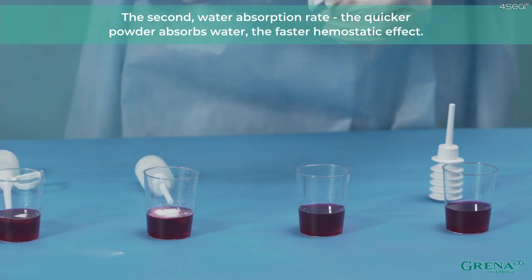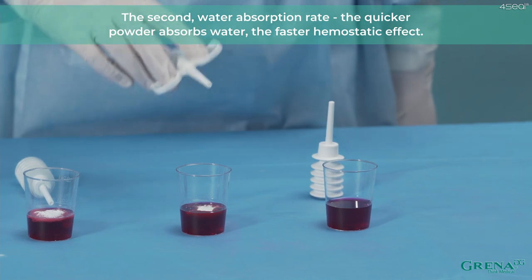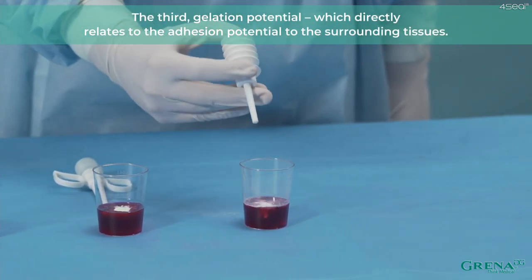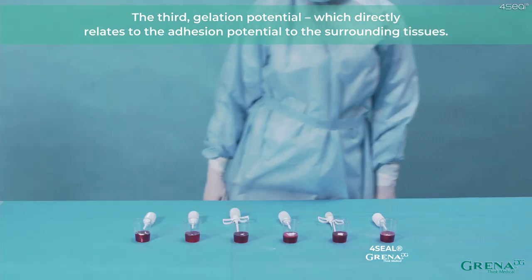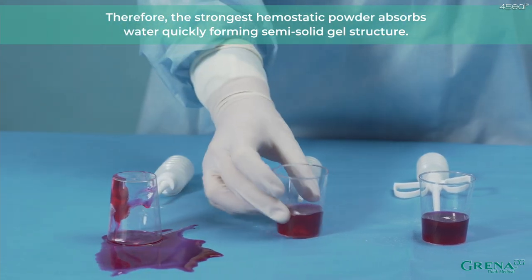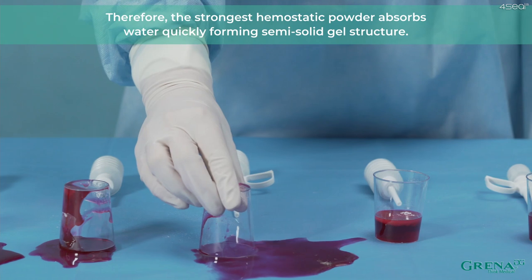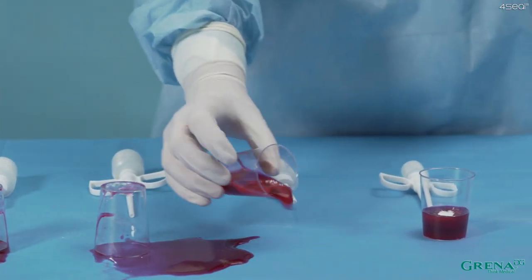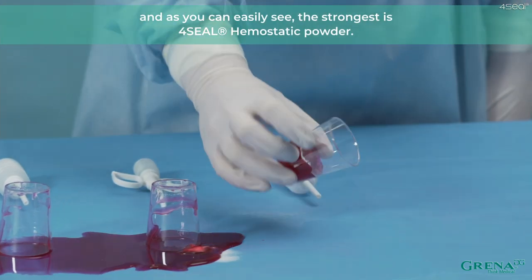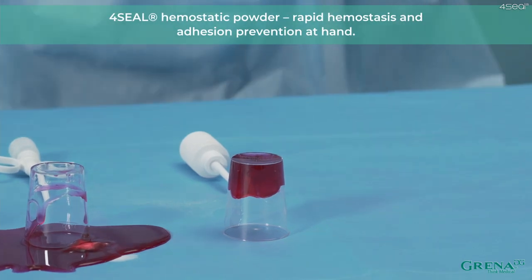The third parameter is gelation potential, which directly relates to the adhesion potential to the surrounding tissues. Therefore, the strongest hemostatic powder absorbs water quickly, forming a semi-solid gel structure. As you can easily see, the strongest is 4Seal Hemostatic Powder — rapid hemostasis and adhesion prevention at hand.